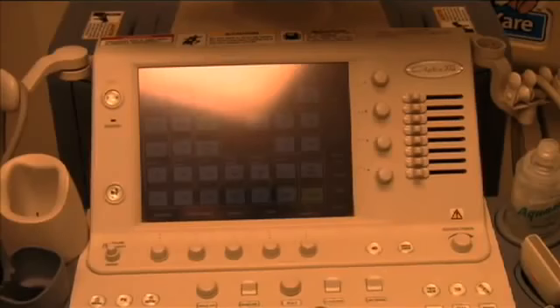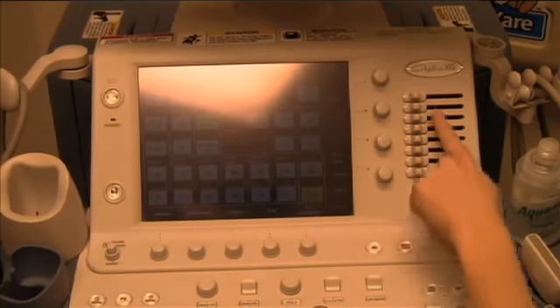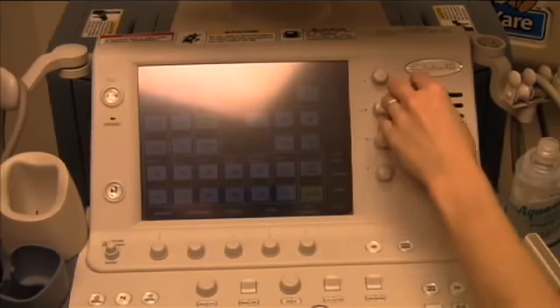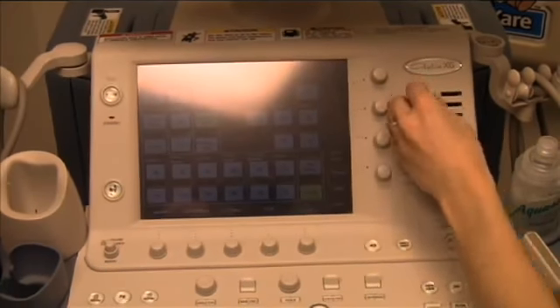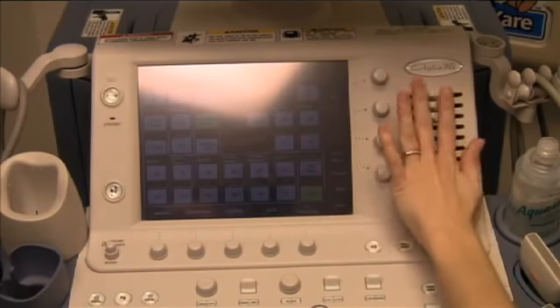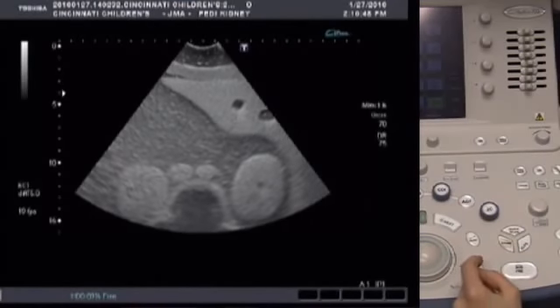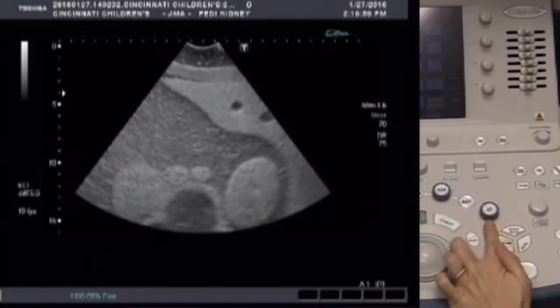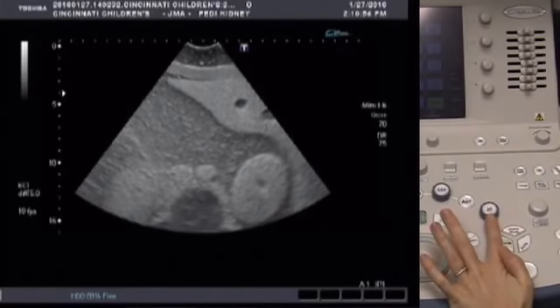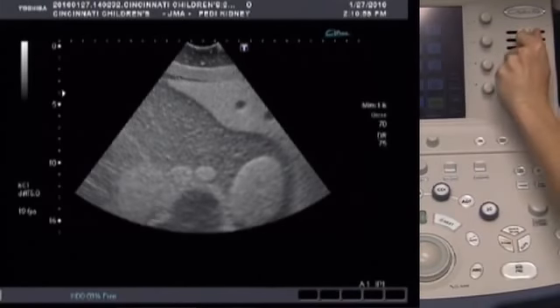Next, we're going to adjust the TGC, or time gain compensation — these are the dials that slide over. Sliding the top dials adjusts the superficial part of the image, and the bottom dials adjust the deeper part. To adjust the gain of the entire image, press the 2D knob and then turn it in the direction of either lighter or darker. This is equivalent to sliding all of the TGC knobs to the right or to the left.